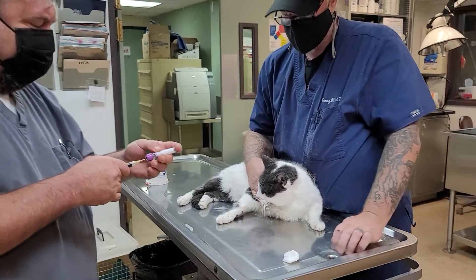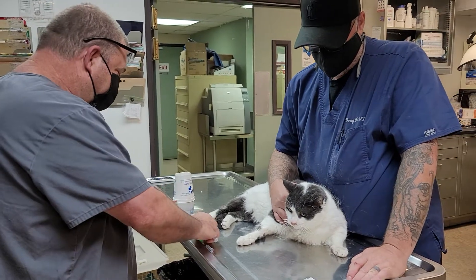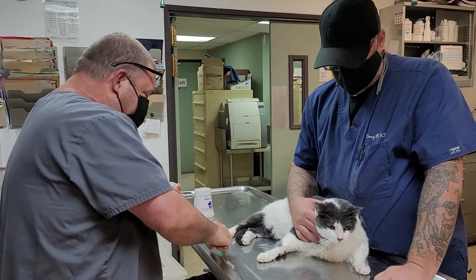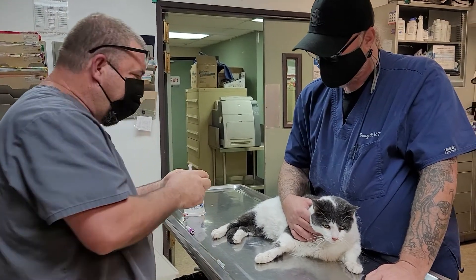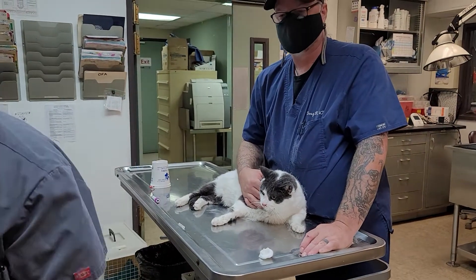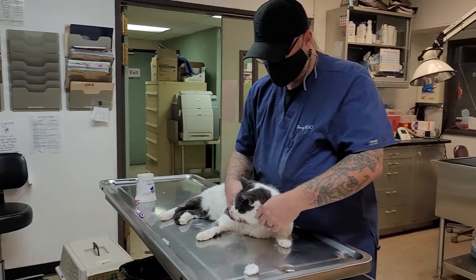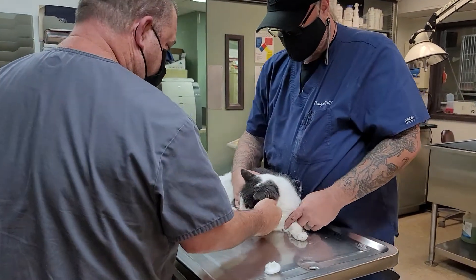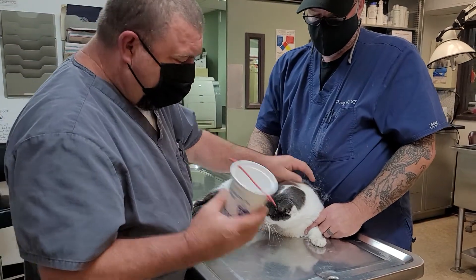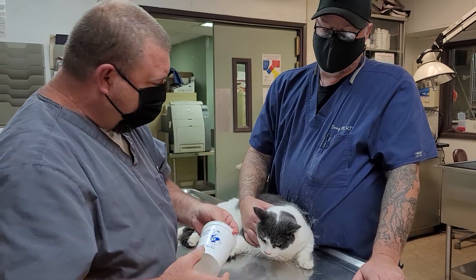Another thing I want to show you is a muzzle that we've designed that works super-duper good. This is just a cup — cut the bottom out of it and make two holes with a rubber band of some sort.